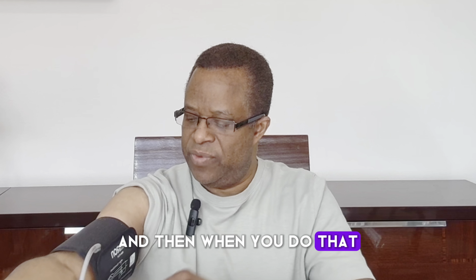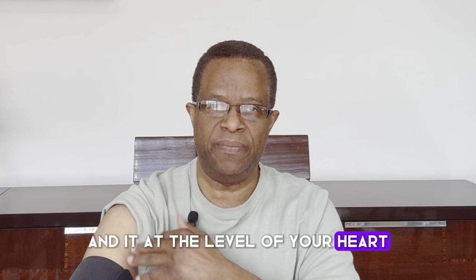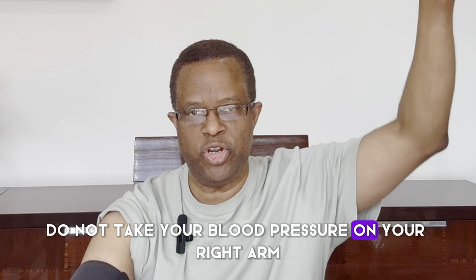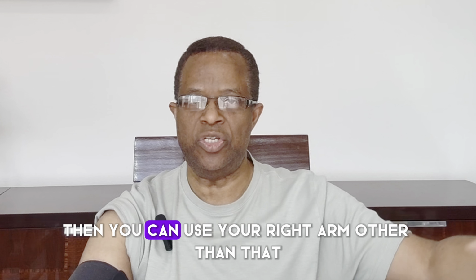And then when you do that, you put your arm on the table and it's at the level of your heart. Do not take your blood pressure on your right arm unless you have had a lymph node dissection for breast cancer and so you cannot use your left arm, then you can use your right arm.